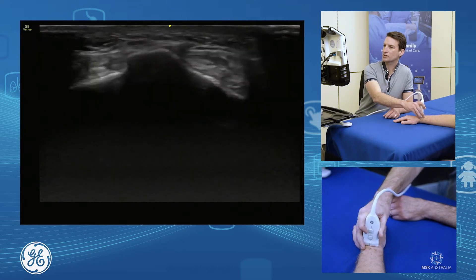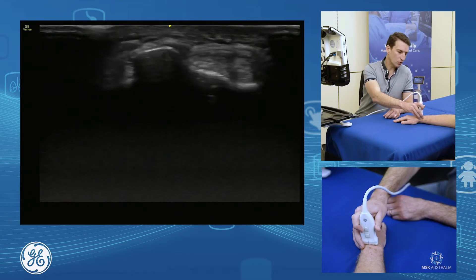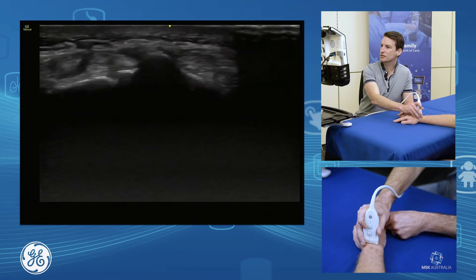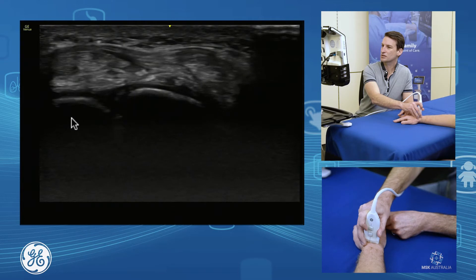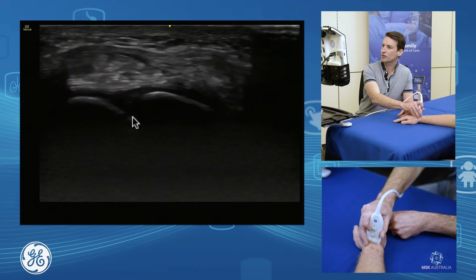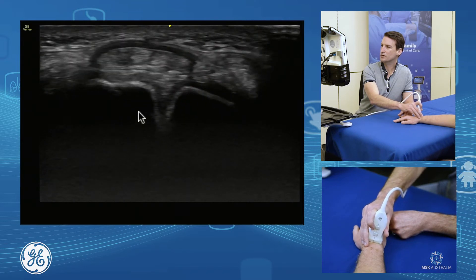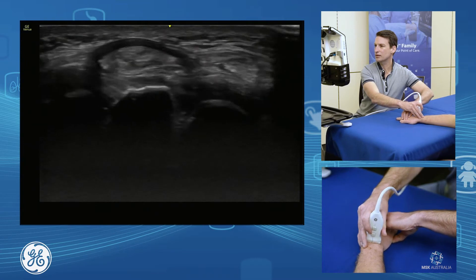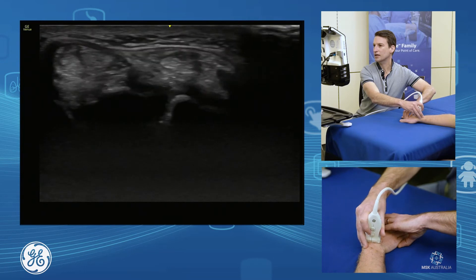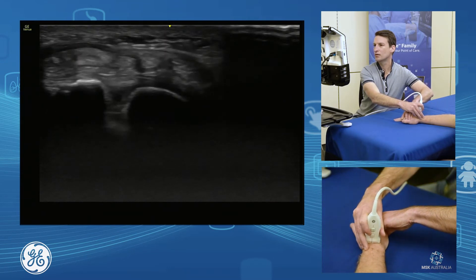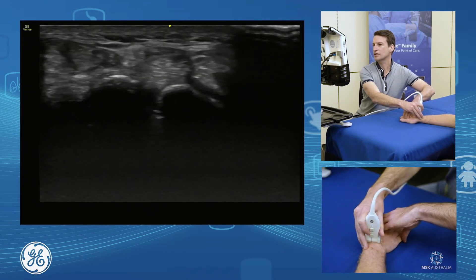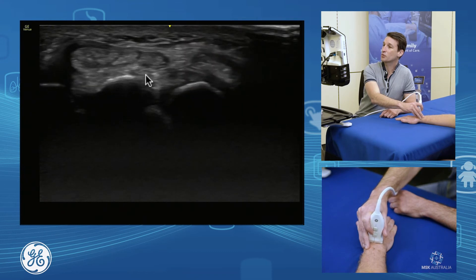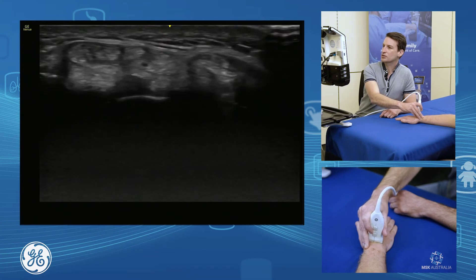Coming back across, we're going to have a look at our scapholunate ligament. The landmark we want for that is our Lister's tubercle. We find our Lister's tubercle, put our probe on, and then just fall off distally — we will have our scaphoid and lunate there. I'm just going to roll around to be perpendicular to that ligament. We can see that ligament sitting between the two bones. To stress it, we can radial and then ulnar deviate. We can see that nice intact ligament across there. This is also a very common spot just underneath our extensor digitorum communis compartment four tendons for dorsal ganglions, so we want to assess up through there.